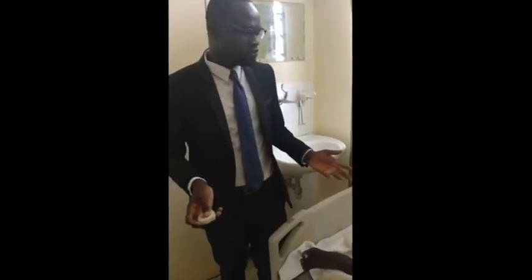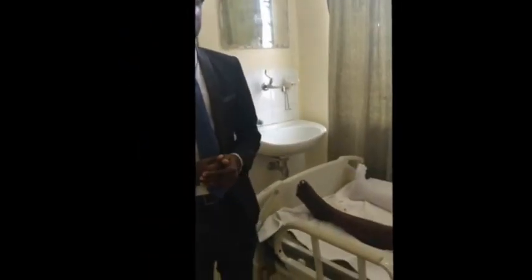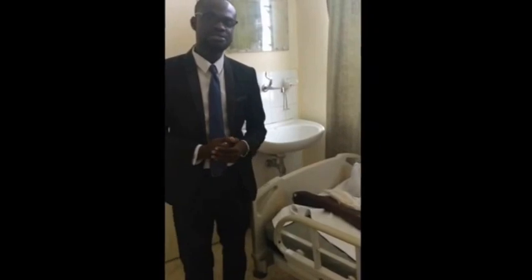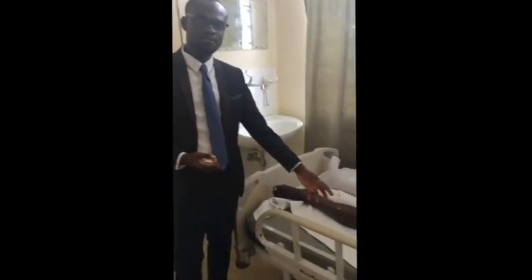So for the procedure, before anti-embolic stockings are applied, you first need to explain the procedure to the patient, which I've already done. The patient has agreed. I've ensured there's enough privacy. Once I have this, I wash my hands, which I've already done. After washing my hands, the next thing I have to do is measure the lower limb.